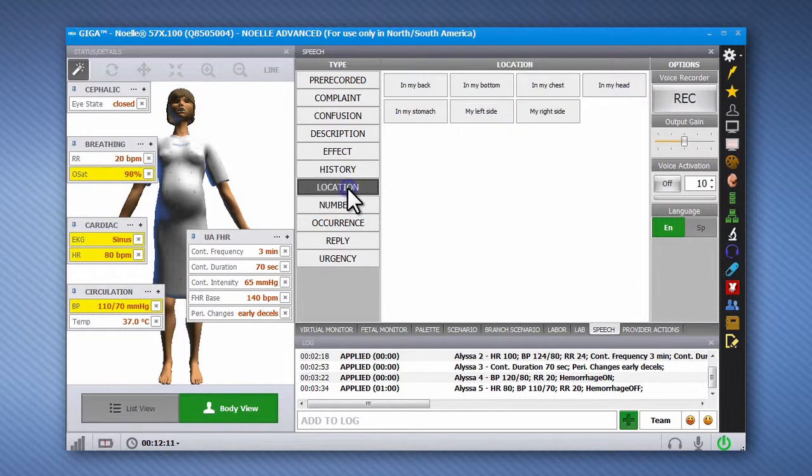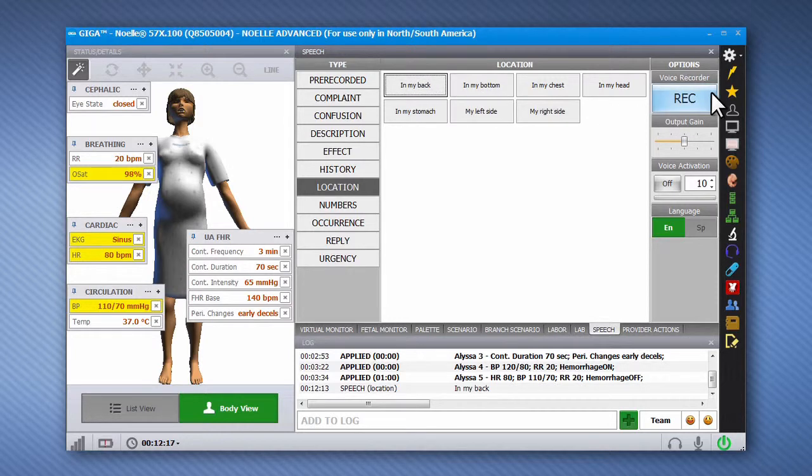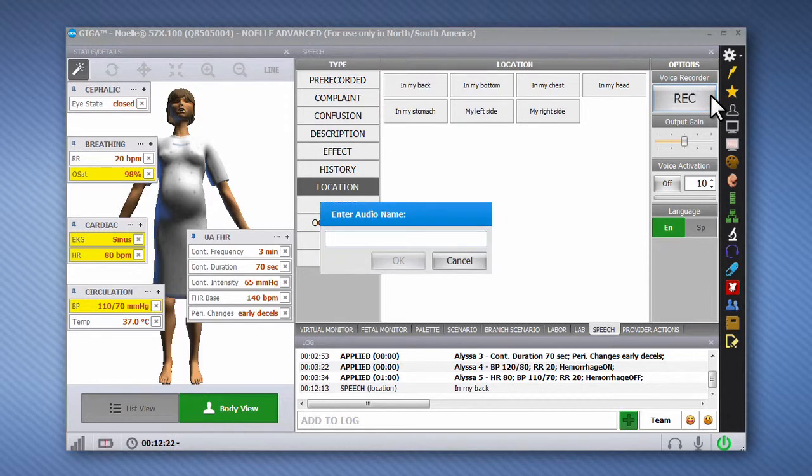To have Noelle speak aloud, press the applicable phrase or response for the situation. In addition, the built-in speech recorder allows the operator to record custom phrases to expand the speech library.